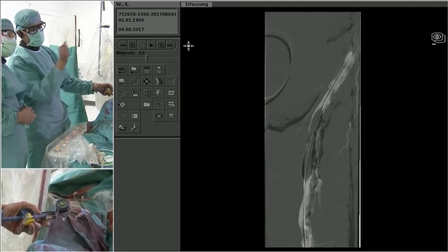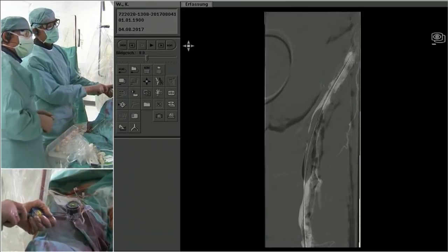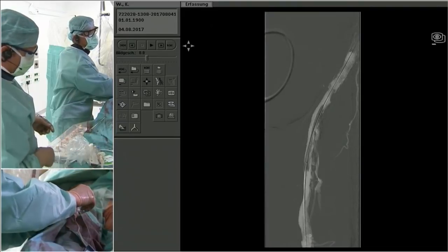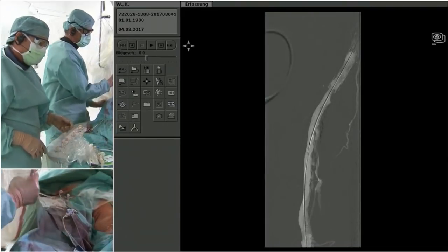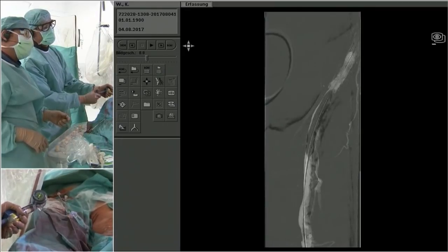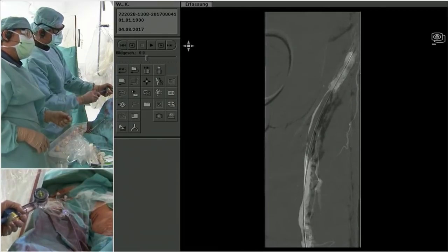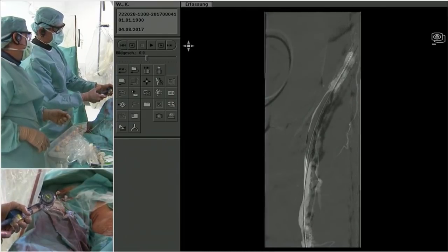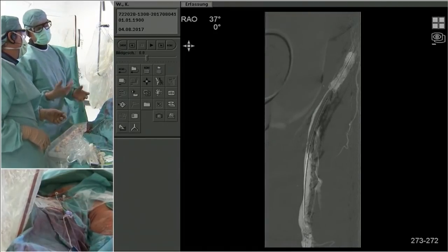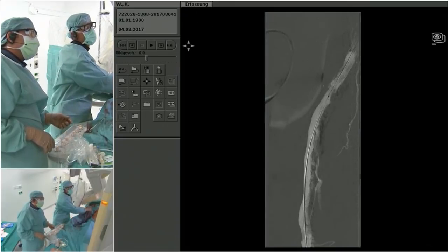Any other comments from the panel? Ian, you are a big expert in using Ocelot crossing catheters. Do you see hope for it in this situation? No, I think there's so much calcium there. I think your approach of going subintimal from the start, just a wire and a catheter, I don't think trying to stay luminal here has any benefit. So much calcium. Is there anyone in the panel who would use a crossing catheter in this case? Anyone?